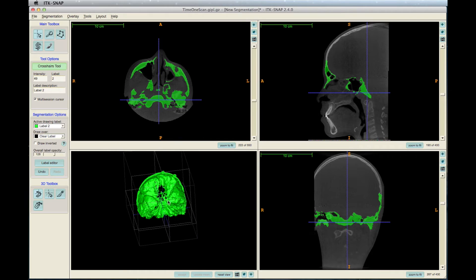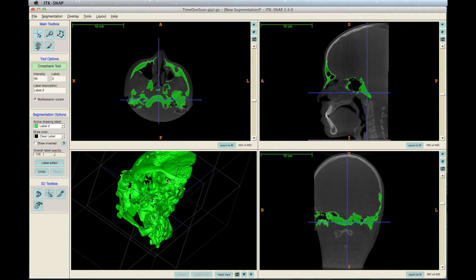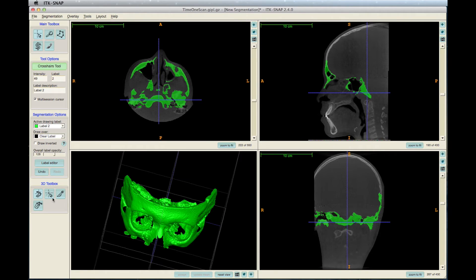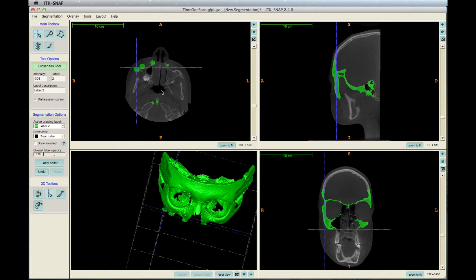It might have some deformations, but you can erase them with the Paint Brush tool. First, under 3D Toolbox, click the cursor and axis icon, which is in the middle. Then click the specific area in the 3D model with the deformation. Under the main toolbox on the left, select the Paint Brush icon. You can set the size and shape, and also set it as a 2D brush or a 3D brush. The 2D works just on the current slice, and the 3D works on multiple slices near the current slice, depending on the size of the brush.